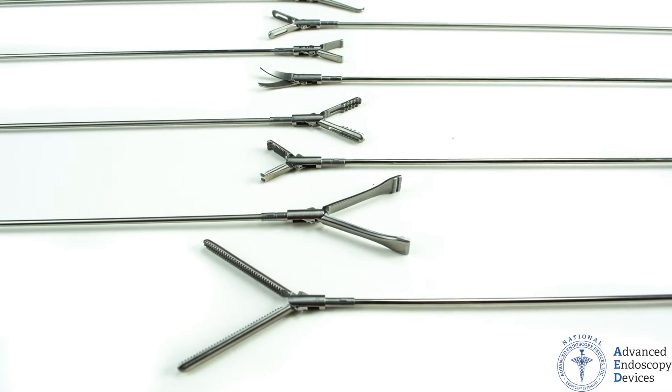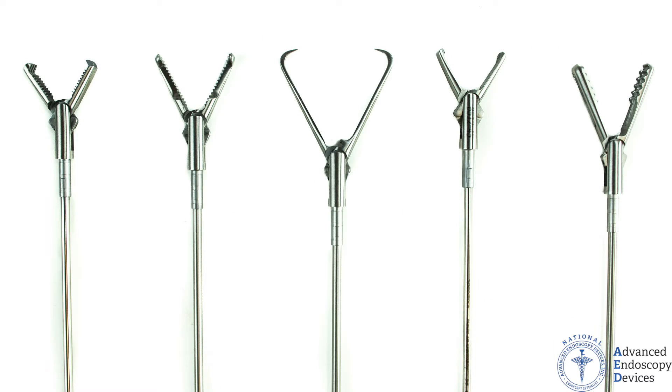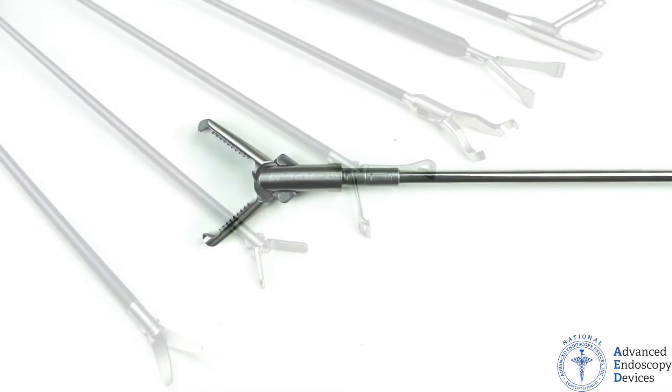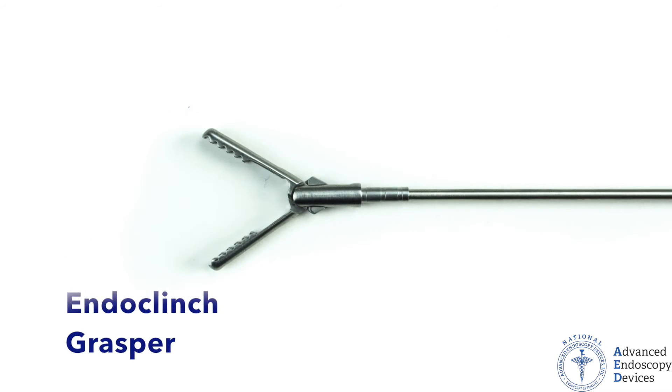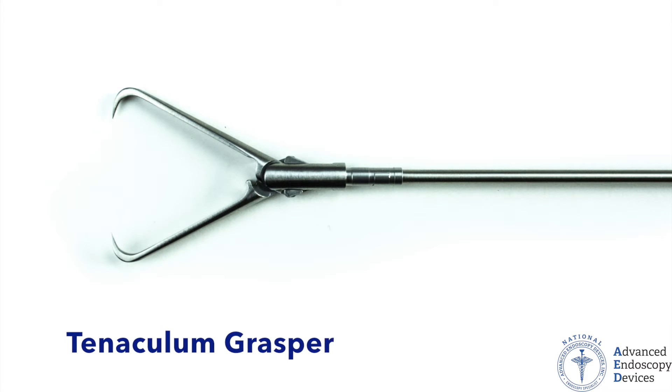All SpeedLock jaws are manufactured from high-grade German stainless steel, making it harder and better resistant against torque, tension, and corrosion. We offer the most sought-after jaw options such as the Cobra, Endo Clinch, Alice, Mixter, and the Tenaculum Grasper.